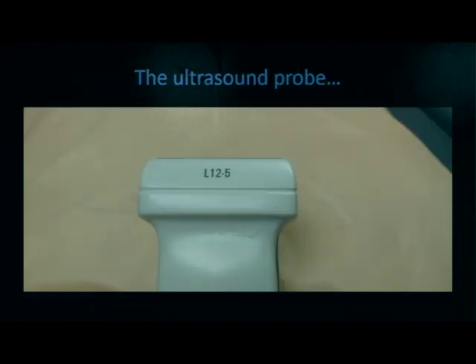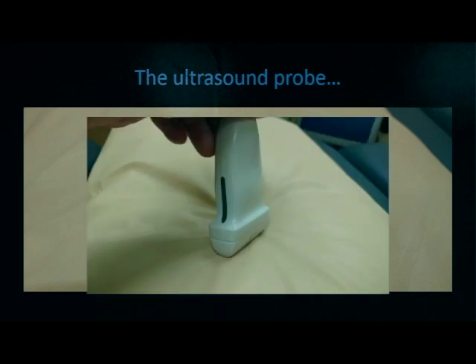When we talk about breast biopsy, we're going to be using the linear probe. It's a high-frequency probe that has excellent spatial resolution but poor depth penetration. But for the most part, this will do just fine for most ultrasound-guided breast biopsies. When you hold the probe, it's important to remember your position in space. The probe can be oriented with heel or toe pressure, and can be rocked back and forth, which would cause a change in your image and perception of the needle underneath the skin.